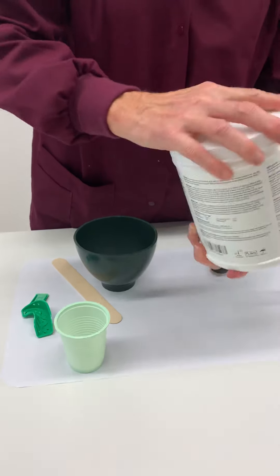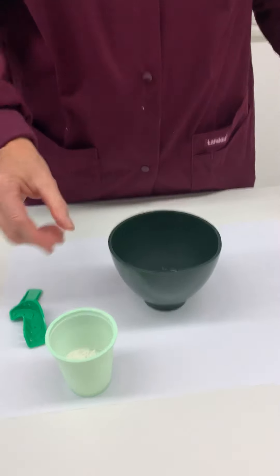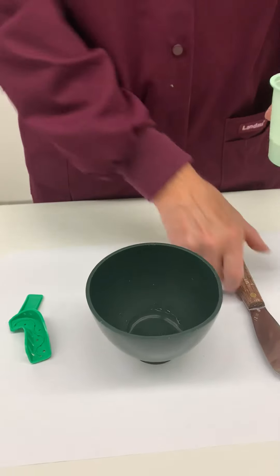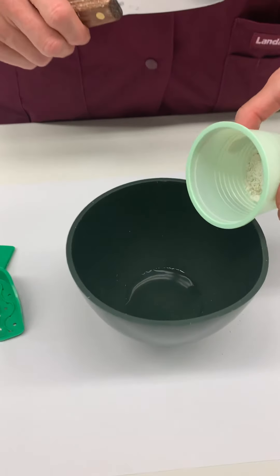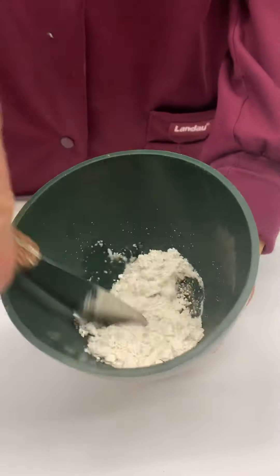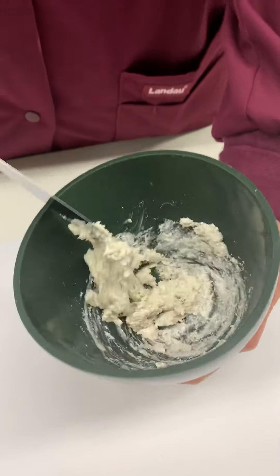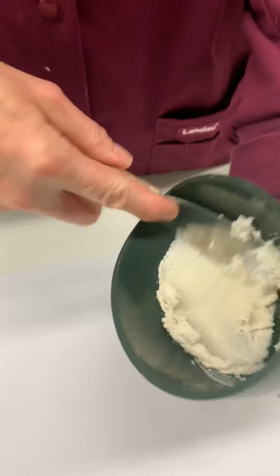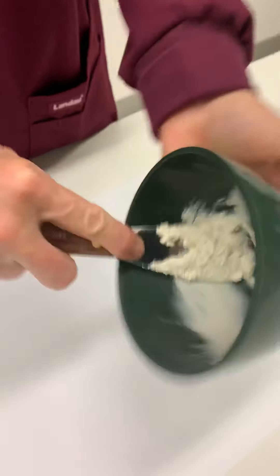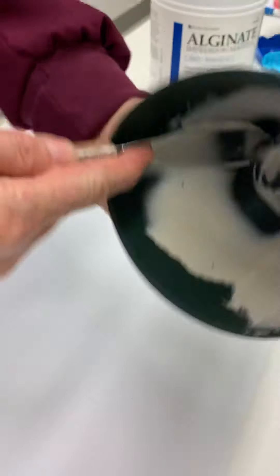Put the lid back on so we don't spill the alginate. Now, our water is already in the bowl — we need our alginate spatula. We dump the powder into the liquid. First, do a little bit of small mixing to incorporate the powder into the liquid, and once it's somewhat incorporated, we can really start good mixing. Always make sure to clear the spatula on both sides.